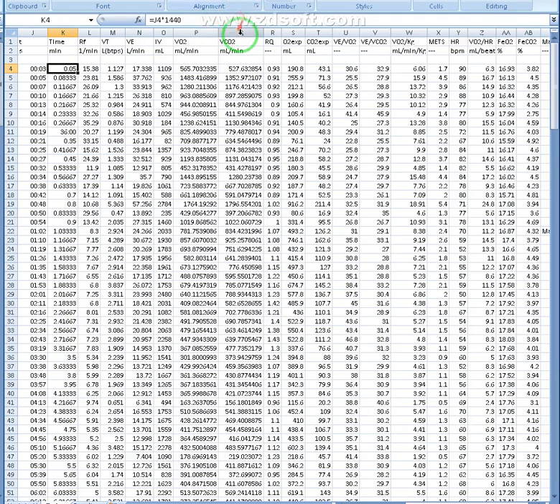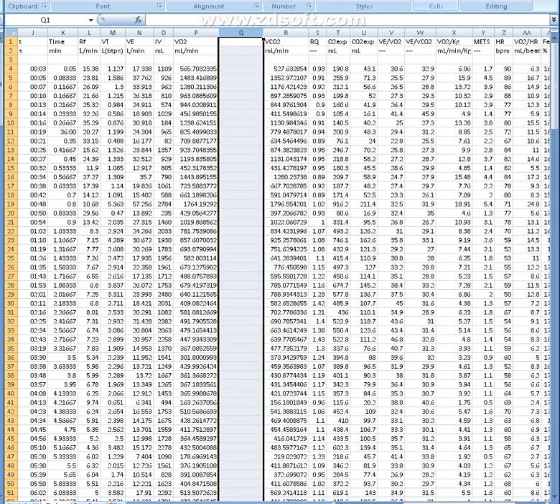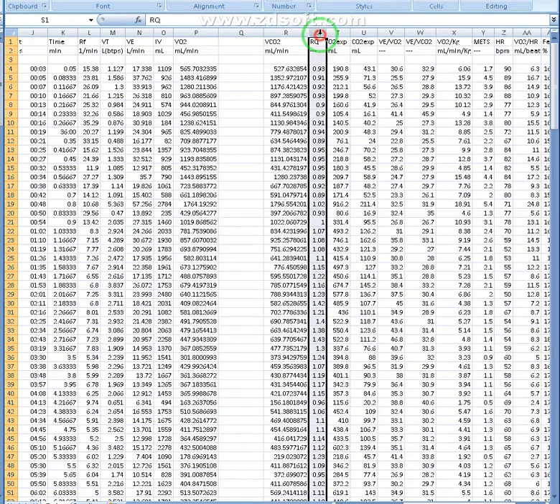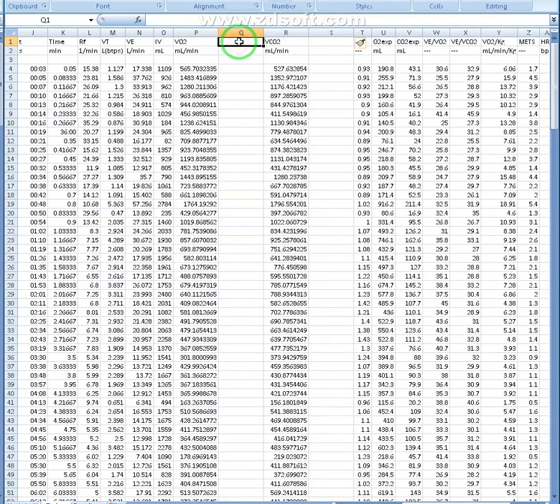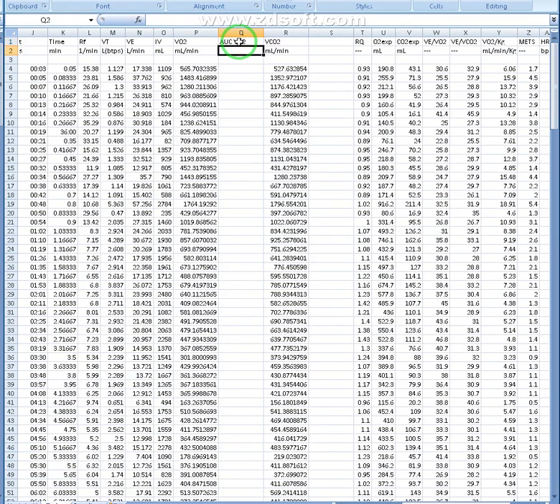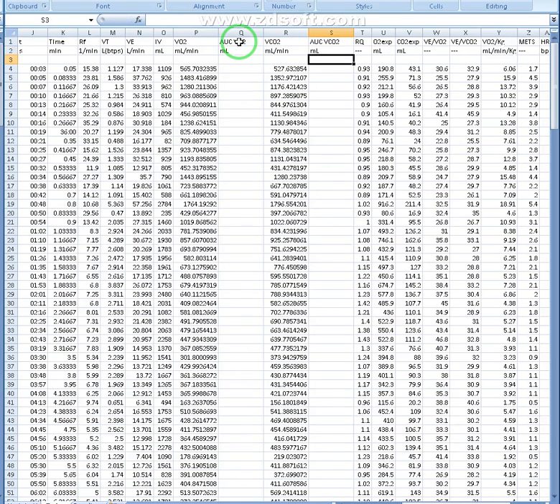Then we need to come on over to Q, we're going to click insert there, and then come over to S, and click insert there. This will be our area under the curve for VO2, it's going to be in milliliters. And this is area under the curve for VCO2, and that's again going to be in milliliters.